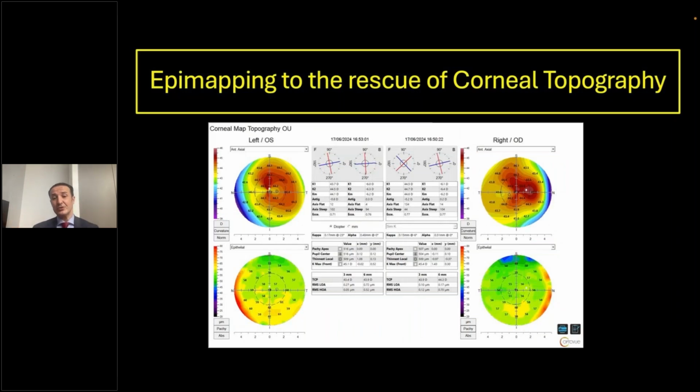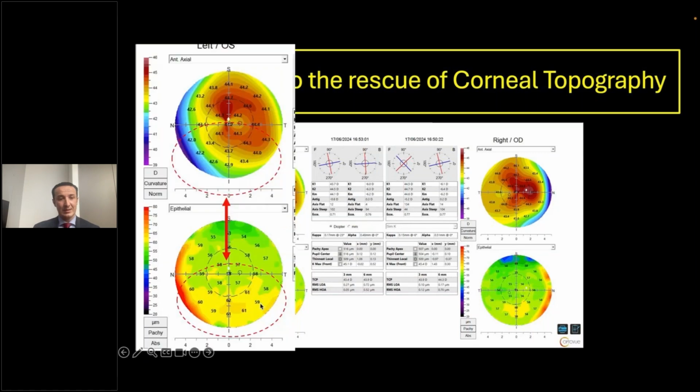And you can also better diagnose the asymmetry due to the dry eye, whether in a keratoconus patient. And look, in this case, you can observe an asymmetry of the corneal curvature. And look here in the Solix, we observe a hyperplasia in the bottom, inducing the curvature changes. And look here, it's very clear. You can make a comparison very clearly.